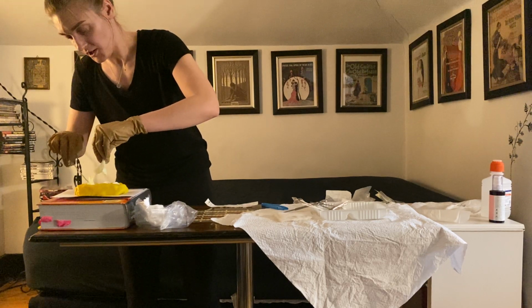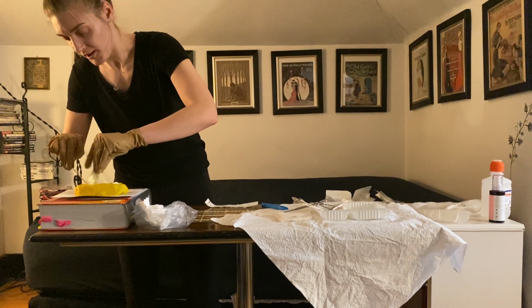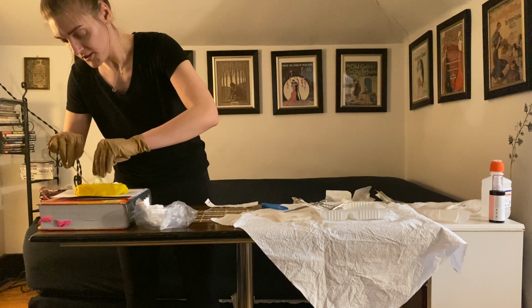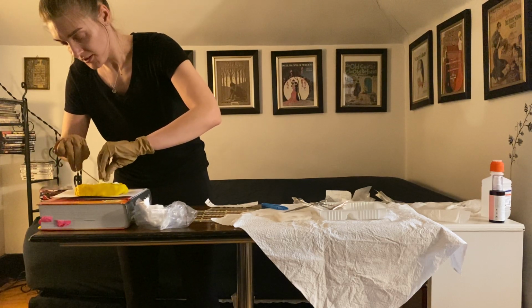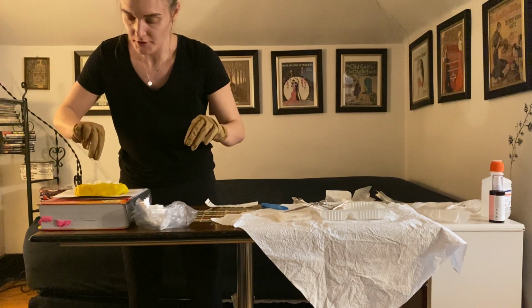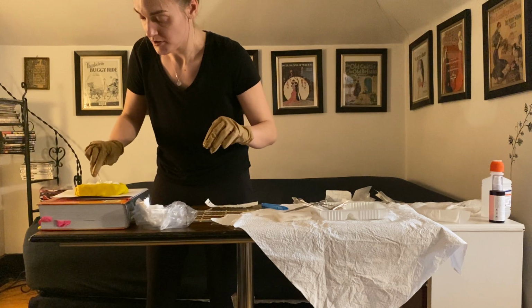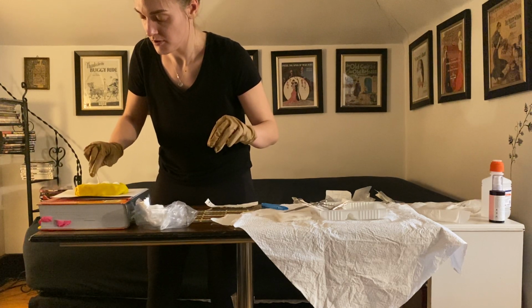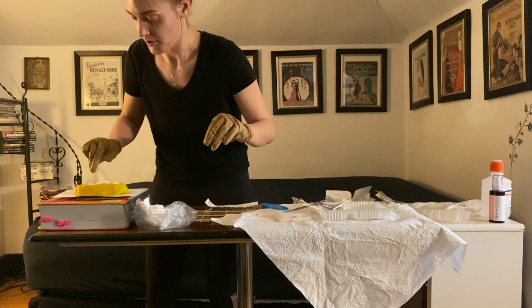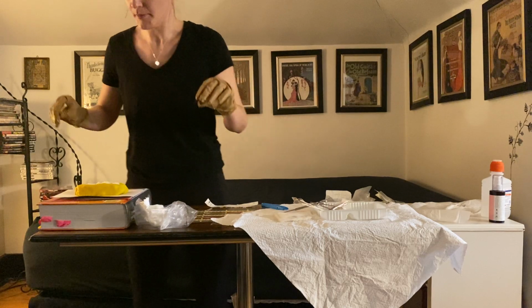And again, it's pre-cut here, but if it was too long, I would cut it to the length that I need because I don't want any excess. So I'm just going to lay that there. And I don't want anything to go above the surface of the wound either. I just want it to be nice and flush. So I'm going to put that down. Making sure all the surfaces are covered. It's not going too far. Okay, so I'm happy with that.